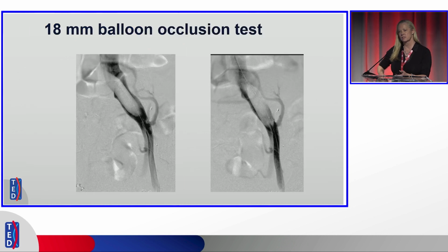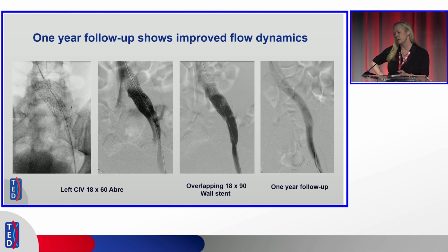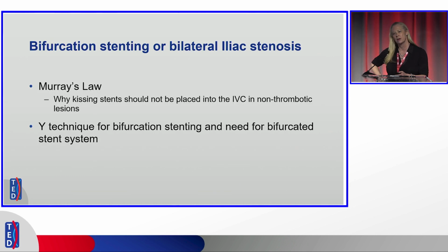So in that scenario, I've kind of developed this trick where if I think I know what size stent I want to put in, you can blow the balloon up and then do a venogram and see how much space you have adjacent to the stent. Is it going to be floating? And if you undersize at the top a little bit, like on the right-hand side, you're okay as long as you have a long segment of anchoring stent below that. So in this patient, the mismatch was so huge, I chose to put in a short 18 millimeter stent at the top and then overlap an 18 millimeter Wallstent down into the external iliac where I got some spasm. But a year later, he came back for some persistent pelvic things where we needed to fix varicose veins. And he has pretty good flow dynamics there. So that worked there, but it'd be really nice if we had some sort of tapering stent.